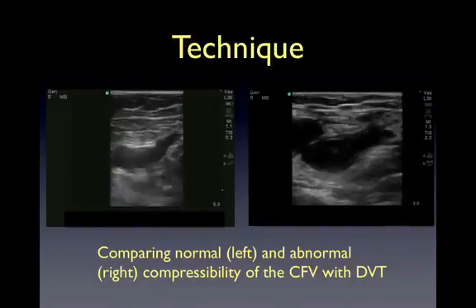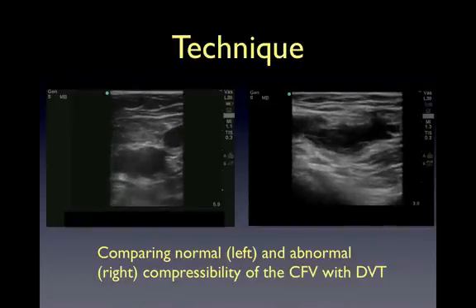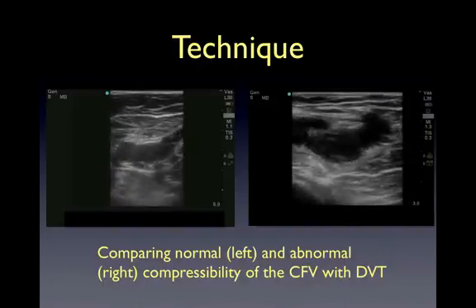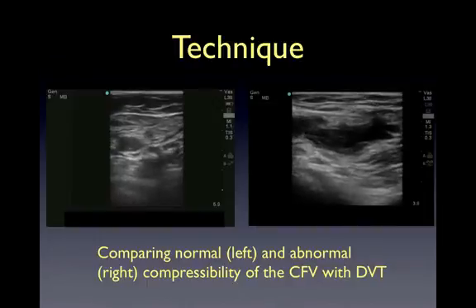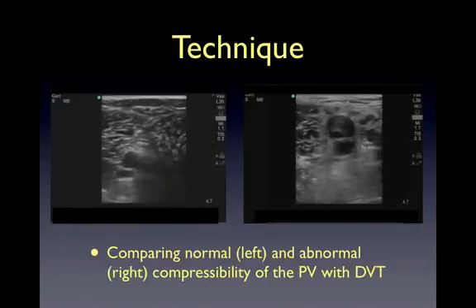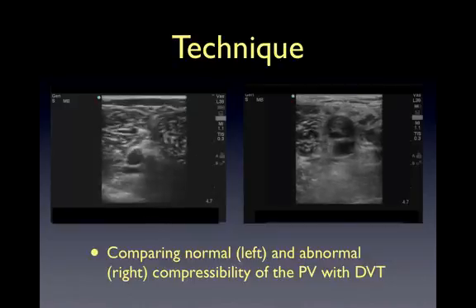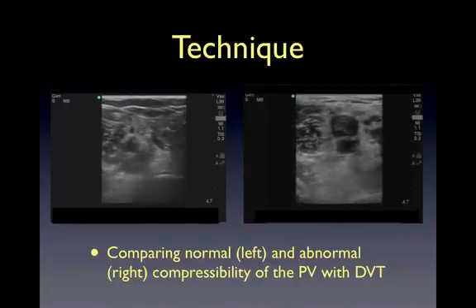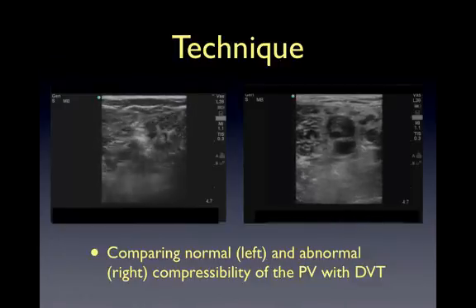Inability to compress the vein fully or direct visualization of a thrombus are evidence of a DVT. Here are two images comparing normal on the left and abnormal on the right compressibility of the common femoral vein with a DVT. On the left image the anterior and posterior walls of the vein are completely touching and the vein disappears; on the right image you can see a clot in the common femoral vein. Here are two images comparing normal on the left and abnormal on the right compressibility of the popliteal vein — remember, the vein is superficial to the artery here. On the left the walls are completely touching; on the right they are not and you can see a clot in the popliteal vein.